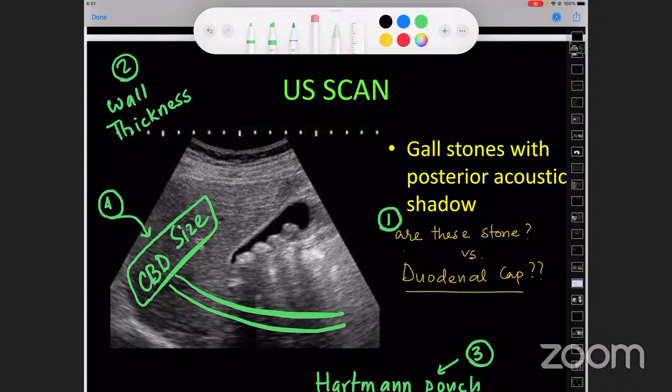So this is absolutely right, because if you're absolutely fasting and you are taking a good amount of fluid, your stomach is filled with water. I think that is the best part to visualize the gallbladder.